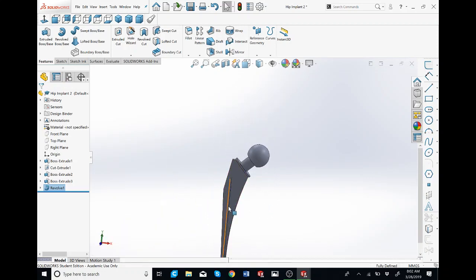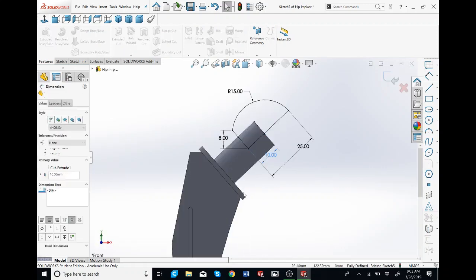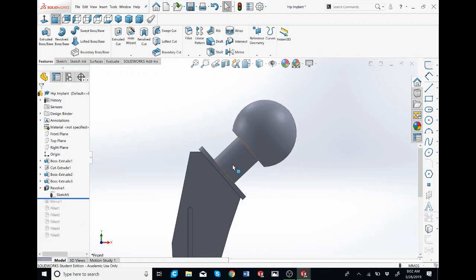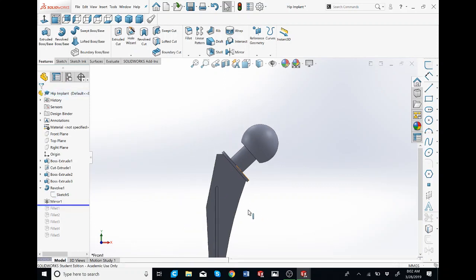These are pretty much the main features of the hip implant. So now we're going to make it look a little bit nicer with fillets. I say fillets, some people say fillets. It's just that I learned it when I was doing tutorials. People say fillets, so it just stuck. Oh, there's one more feature.